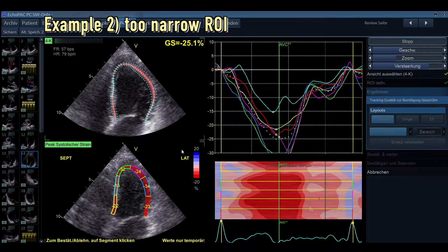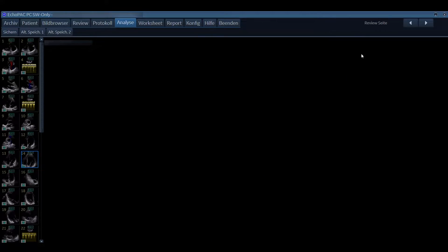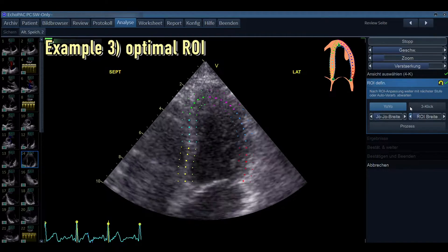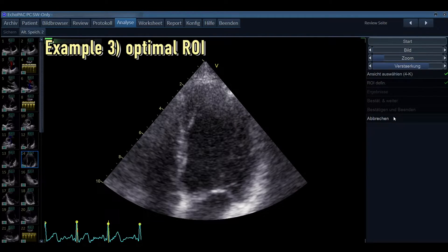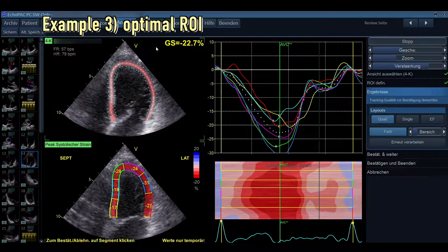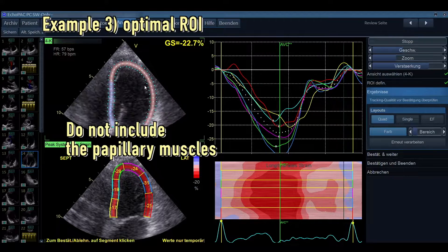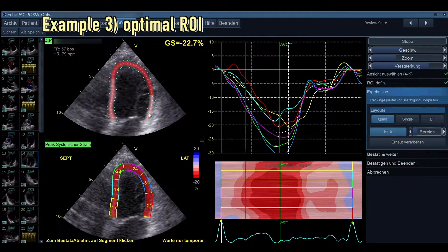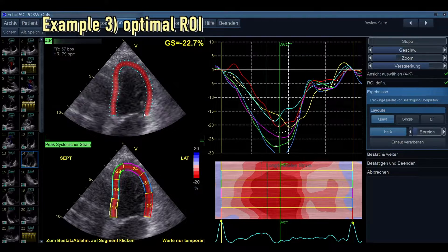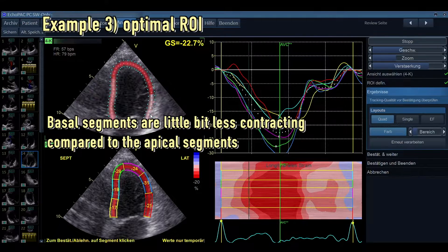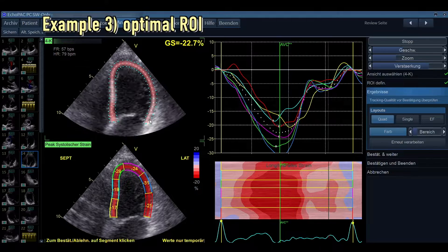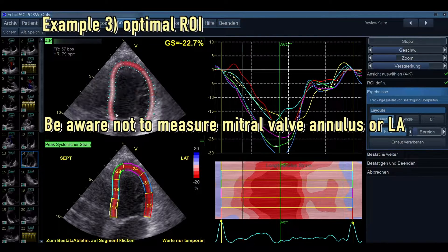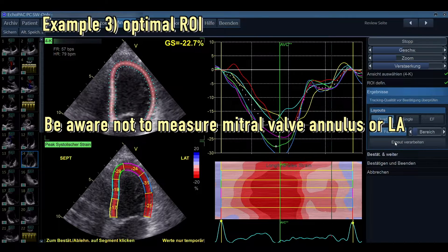Once we stop that incorrect measurement and perform an accurate one — simply adjusting the tracking to the endocardial borders — the machine does it quite nicely with minimal manual adjustment. The result shows a normal longitudinal strain in this apical four chamber view. An important pitfall: do not include the papillary muscles. Also be aware that pulling the speckles too far downward will reduce the basal segment measurements, because you'll be tracking the mitral valve annulus, which is firmer tissue compared to the myocardium.